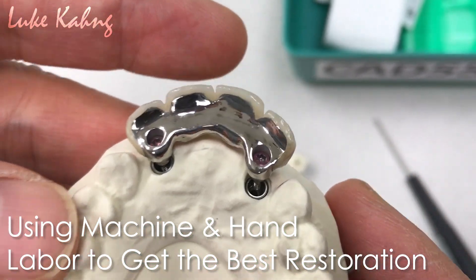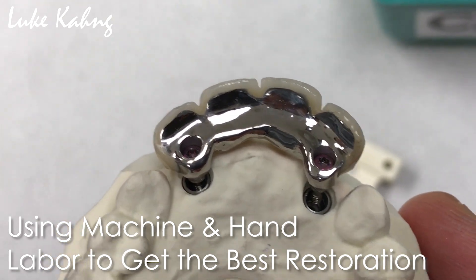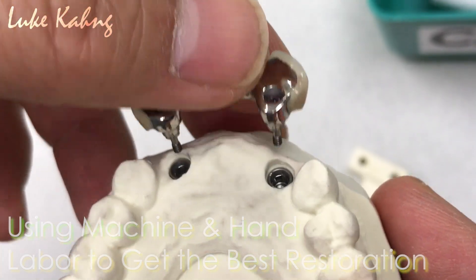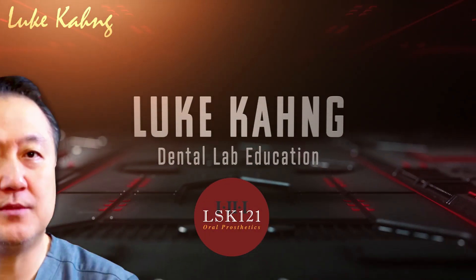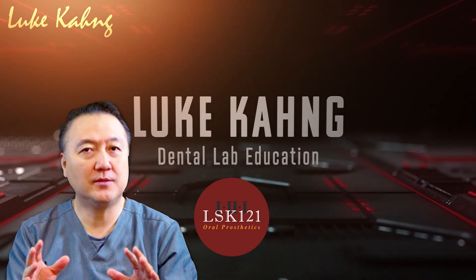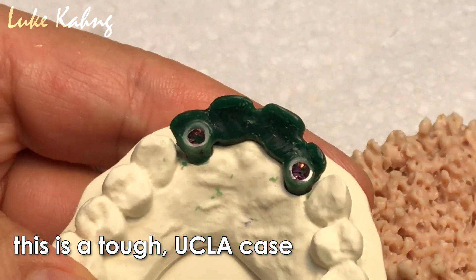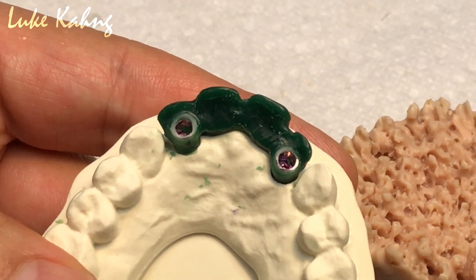Today, screw-retained four unit. This bridge needs some hand skill. Tough case with UCLA. So we're going to casting. This is semi or wide? Semi.